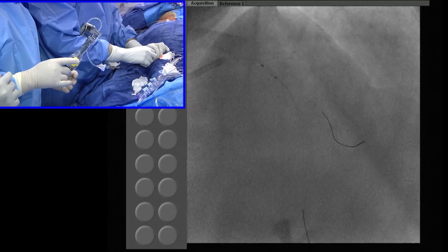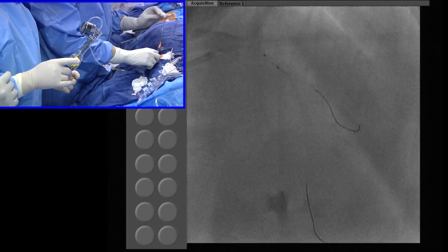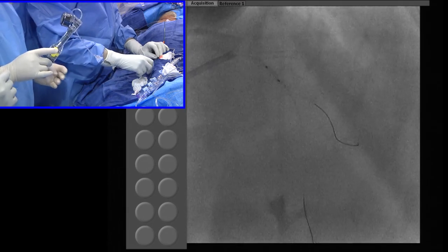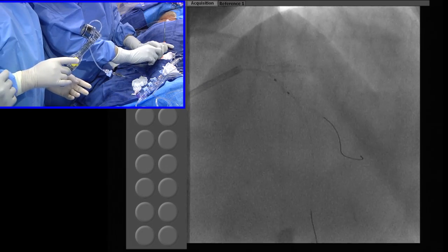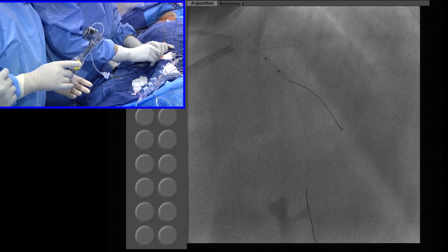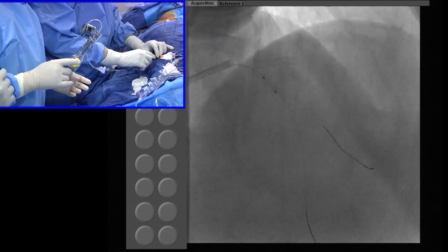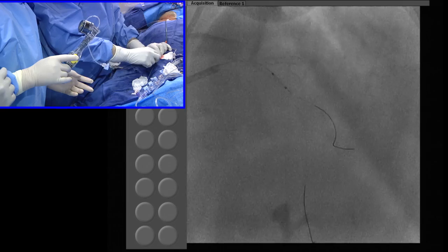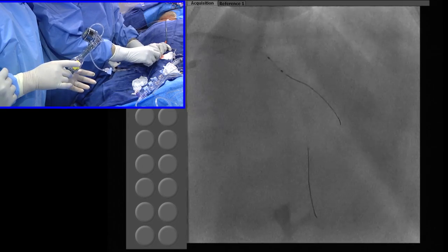See that? That is a chunk, no crisscross, just a chunk of calcium there. I see. So still there is a calcium before the bifurcation lesion, preventing this passage. The flextome can go. Right, we can start cutting from here.